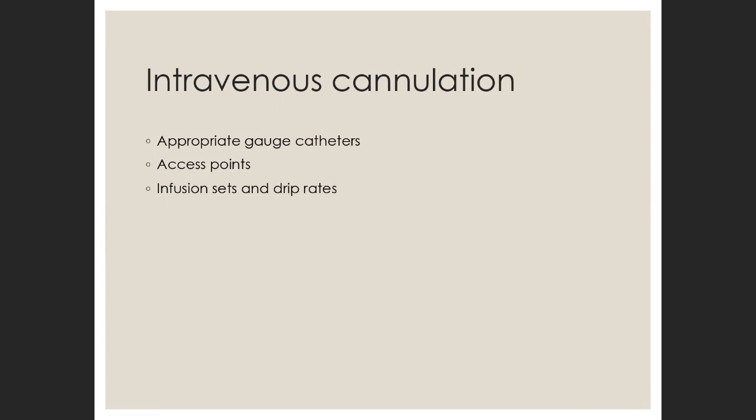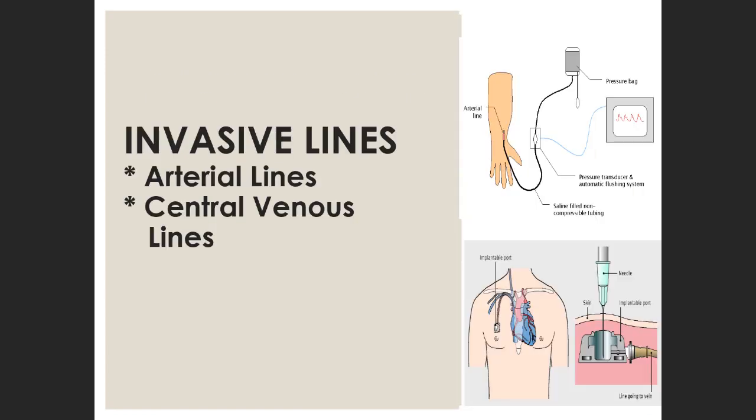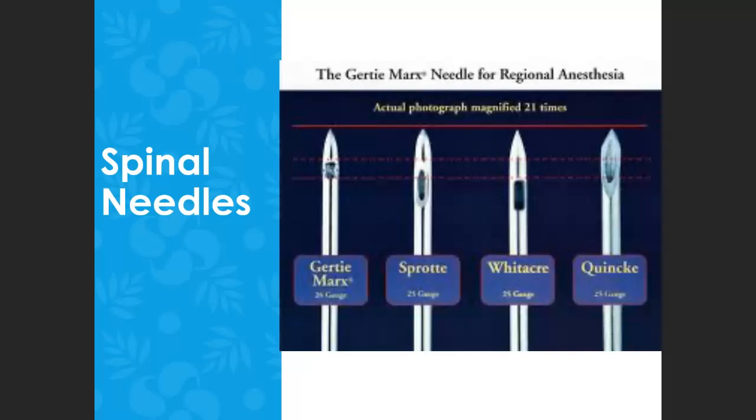All right? Let me see the hands of those who have tried intravenous cannulation. Okay. So we have arterial puncture, IV placement.